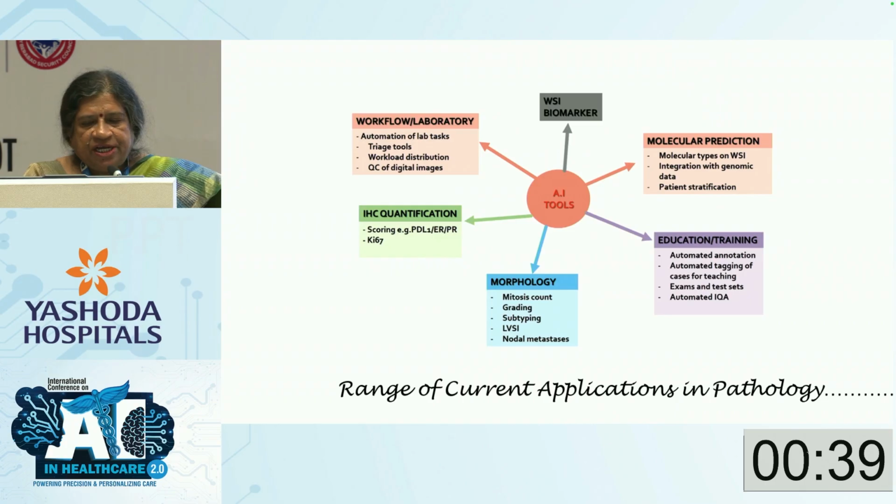So these are the range of current applications in pathology: morphology, IHC quantification, workflow improvement, whole slide imaging as biomarker, molecular prediction, and of course, education and training.